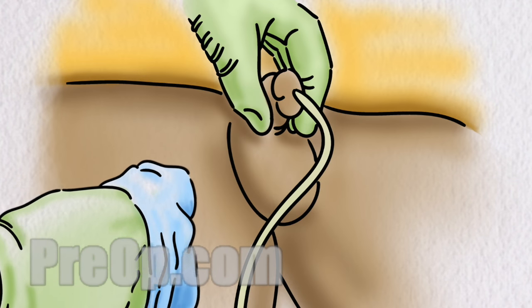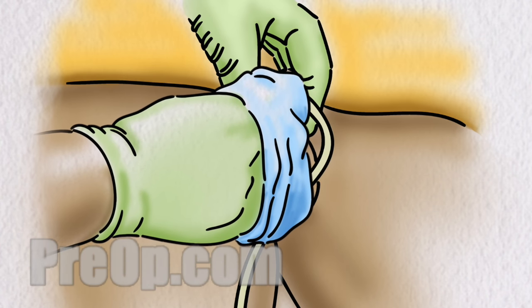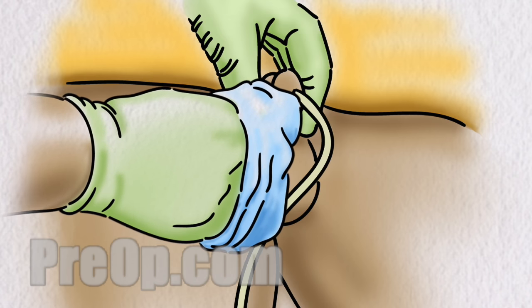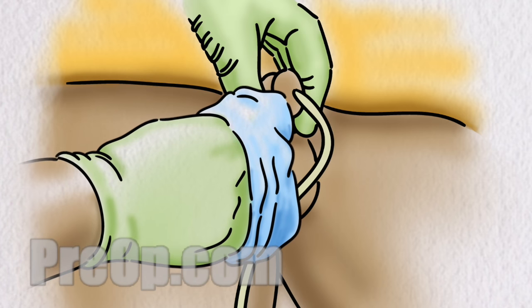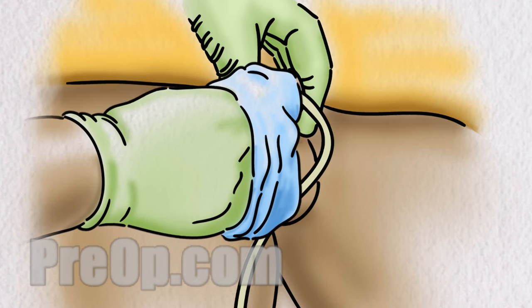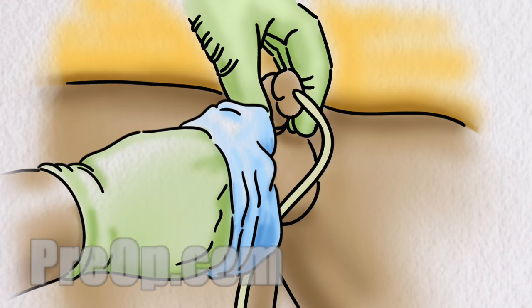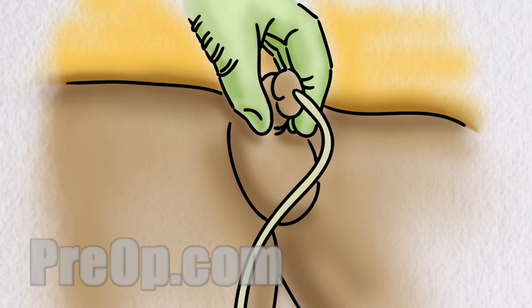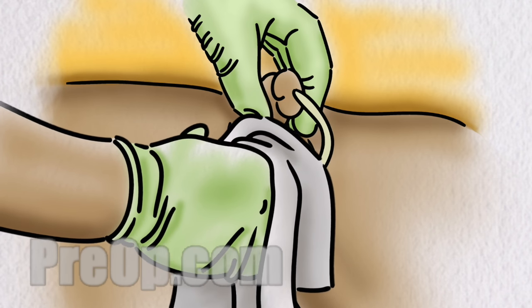Using a fresh clean washcloth, warm water and mild soap, wash the skin around the catheter, penis and scrotum. This area must be cleaned every day to prevent infection. Also wash the catheter, especially where it is close to the skin. You may shower to stay clean, but do not soak in a bathtub. When you are finished, dry the skin with a clean towel.